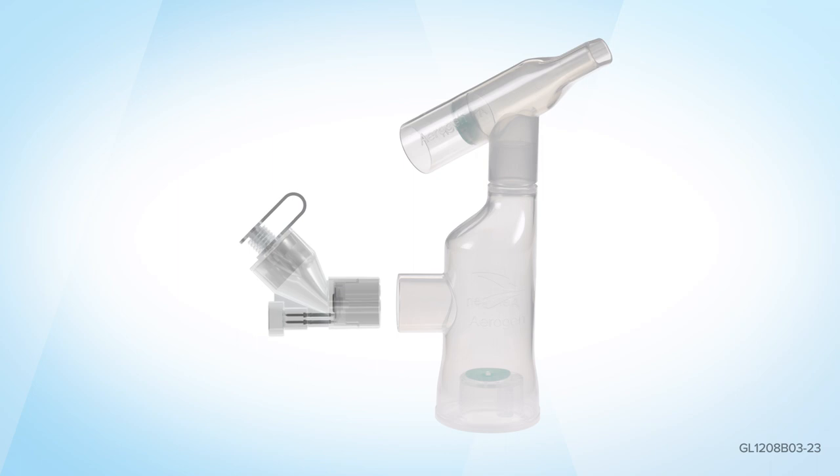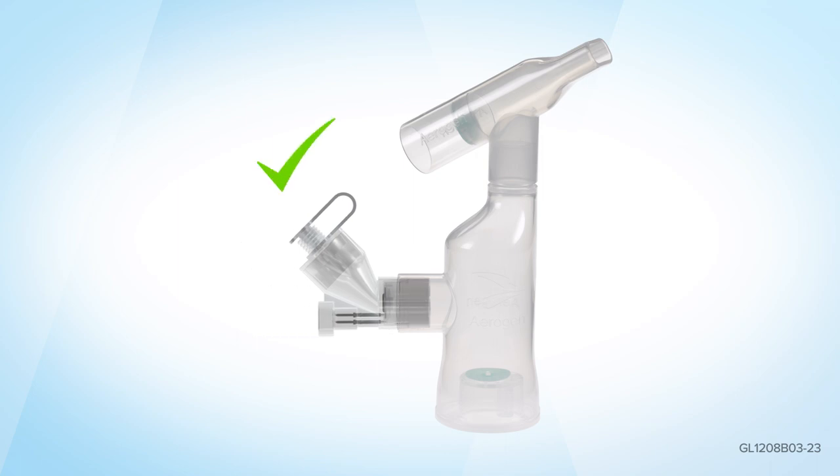Place the Aerogen Solo firmly into the Aerogen Ultra. Ensure correct orientation.